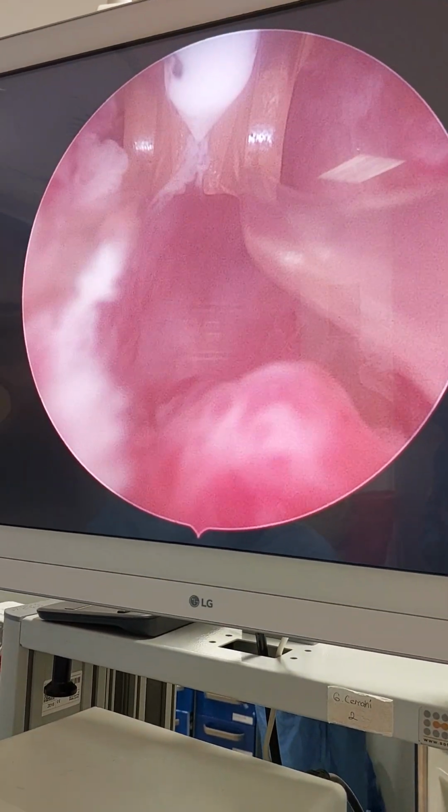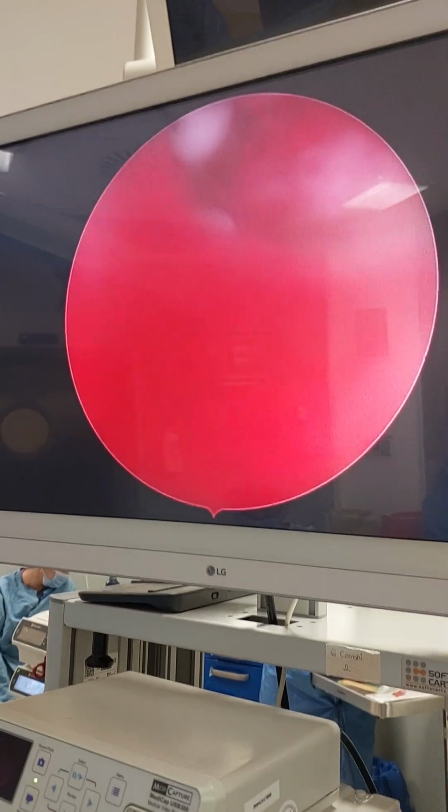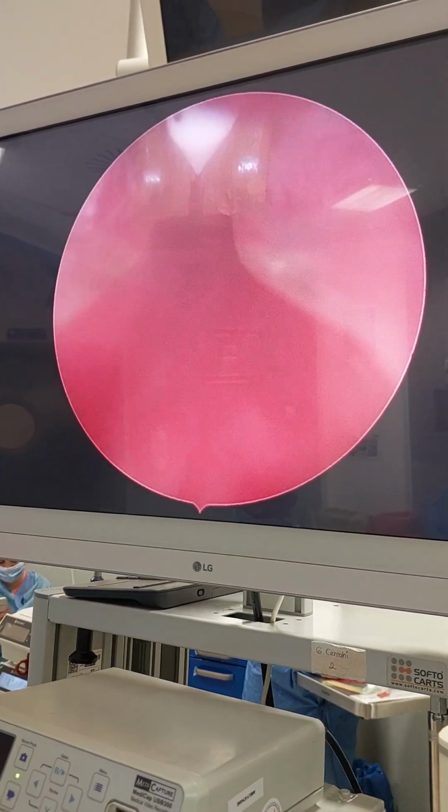Okay, for the left side, I'm satisfied. Look again to the right side. I don't want to leave this. Yeah, okay. I think it must be enough. Okay, so pause. It makes a little bloody making this massage. It makes some hemorrhage here, so it's a little more difficult to identify the structures.